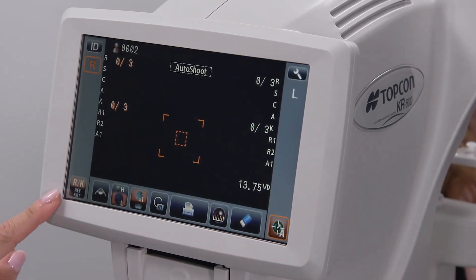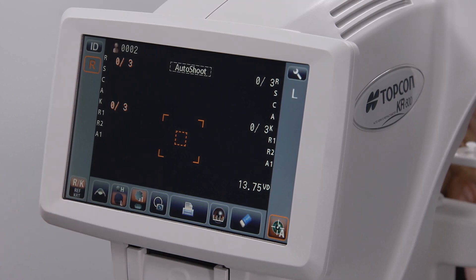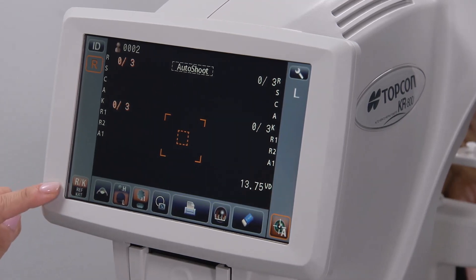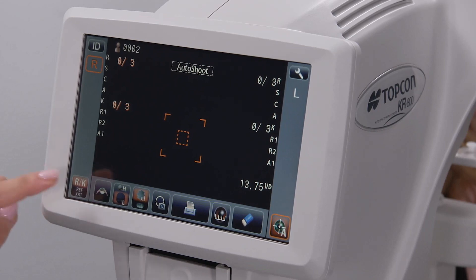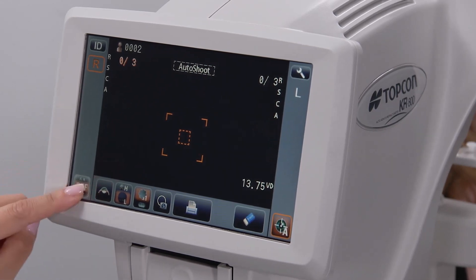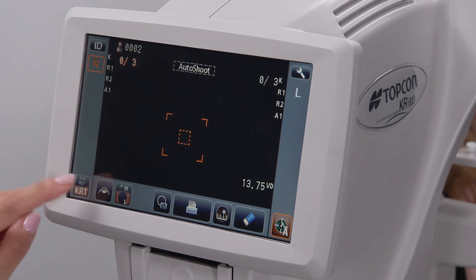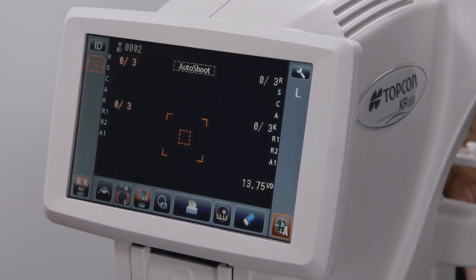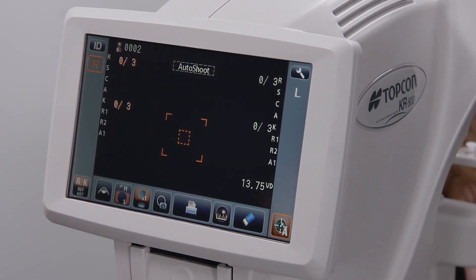The measurement mode icon determines the amount of information that will be acquired during the measurement. Tapping this icon will switch the setting from RK to refraction only, to keratometry only, and then back to RK. By leaving the setting on RK, the device will get both autorefraction and keratometry values.